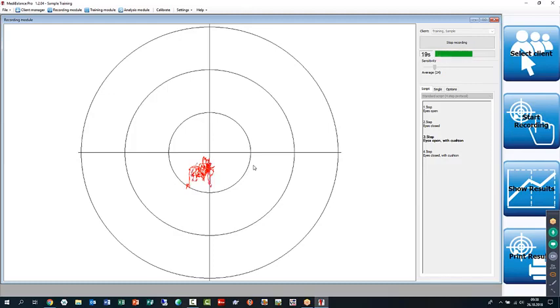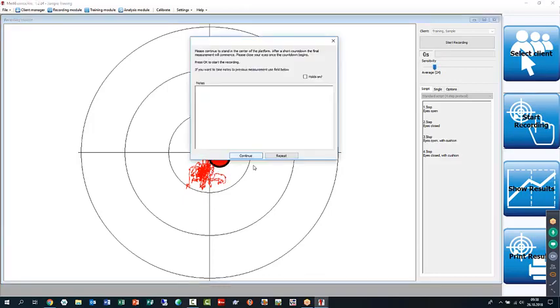And there's less movement because my eyes are now at my disposal and I can use them to hold on in the room with my eyes. So a lot of people use that for compensation and find it quite helpful to do that. And 30 seconds can actually be very long for some clients. So I'm drawing a little bit more here and now we're done.